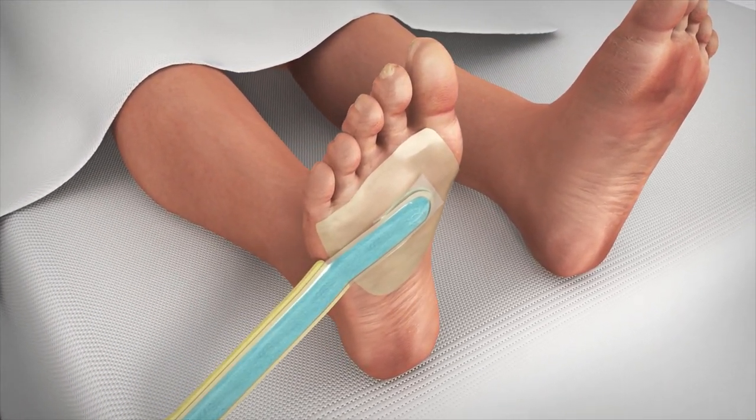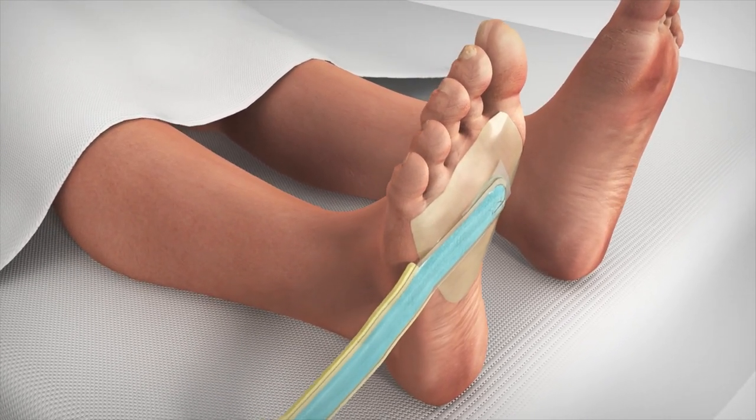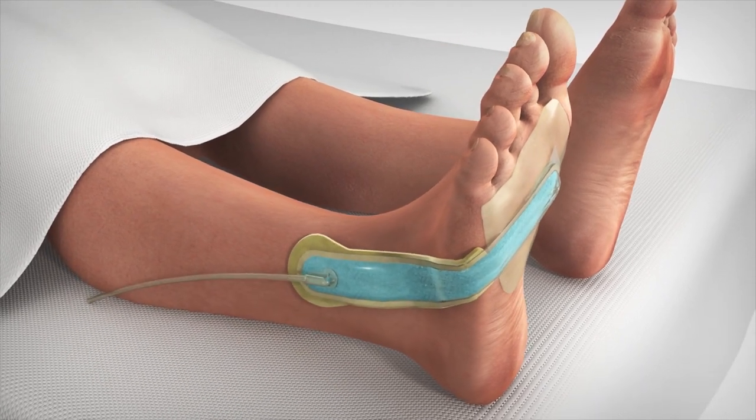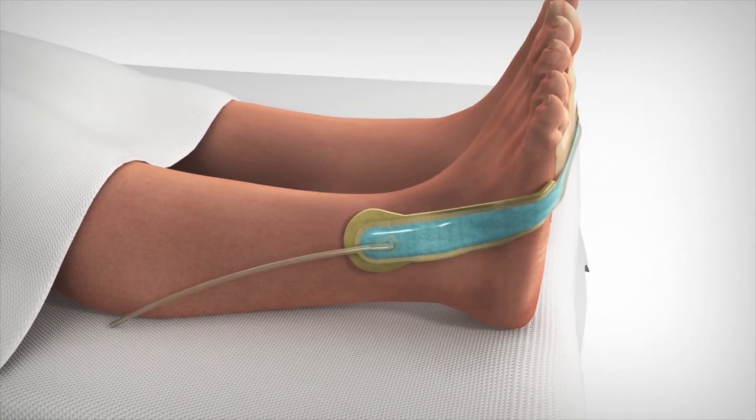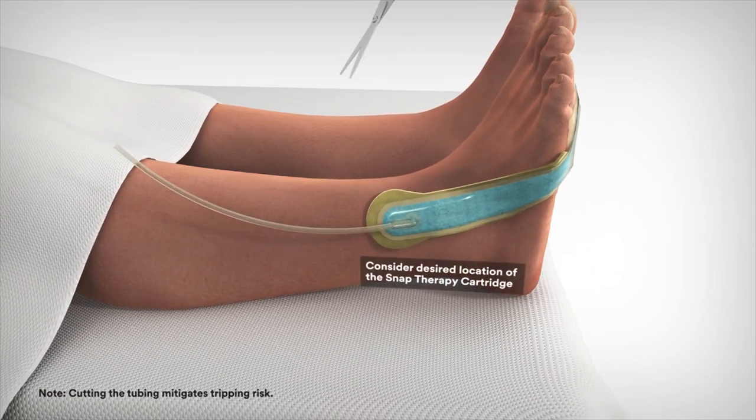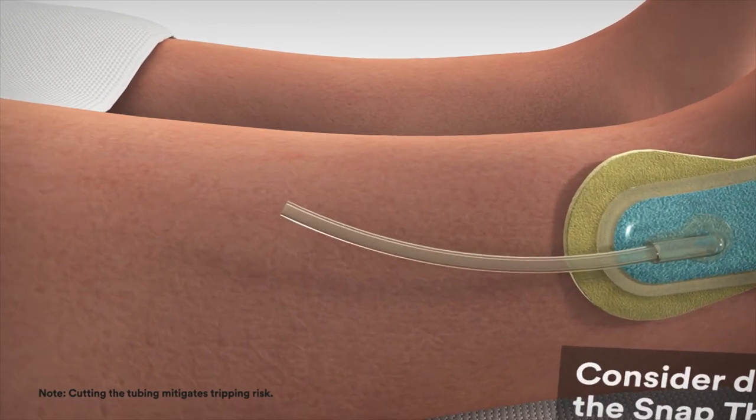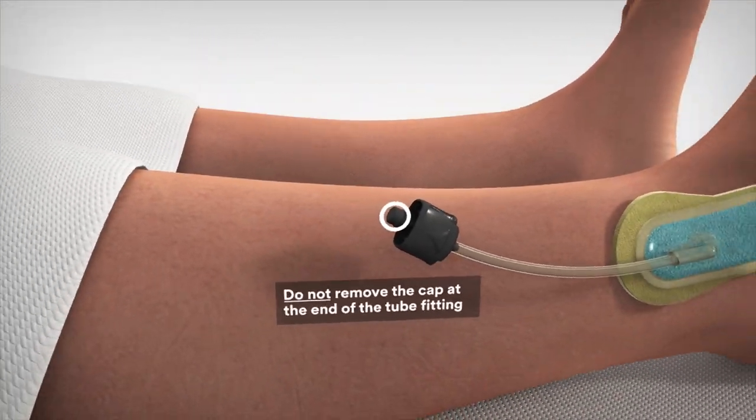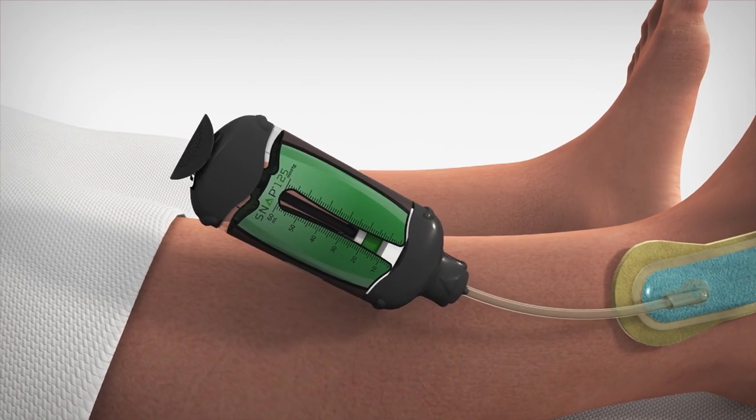It is often helpful to hold your warm hands over the dressing to allow the adhesive to properly adhere to the skin. Route the bridge section of the dressing away from the wound in order to mitigate contact pressure at the wound and secure the bridge section to the patient. Cut the tubing to the desired length ensuring the cut is straight and not at an angle. Fully insert the tube fitting into the tubing. Connect the SNAP therapy cartridge to the tube fitting.